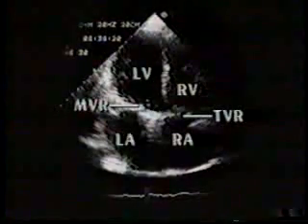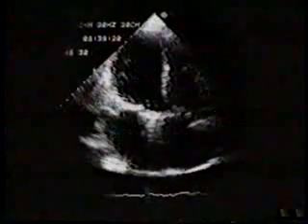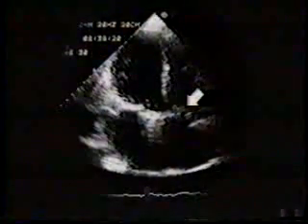Here, left ventricular size and function are normal. The left atrium is moderately enlarged and free of thrombus. This is the 42-year-old female whose mitral Bjork-Schiley prosthesis was previously demonstrated. At this time, we want to direct your attention to the normal Ionescu-Schiley heterographed prosthesis in the tricuspid position.